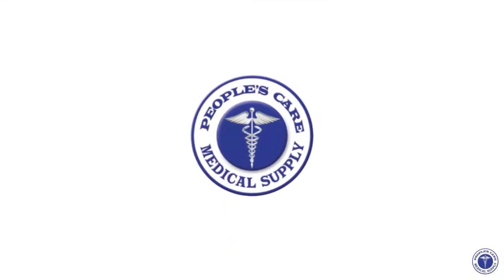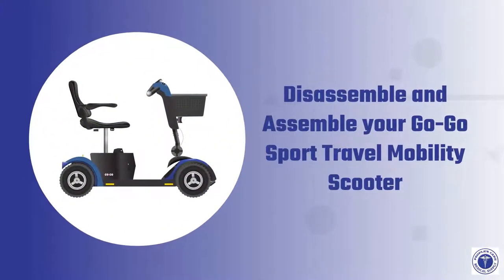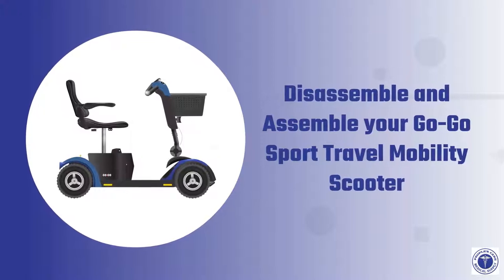Welcome to People's Care Medical Supply. This is an instructional video for our rental guests and buyers on how to disassemble and assemble the Pride GoGo Sport Travel Mobility Scooter.